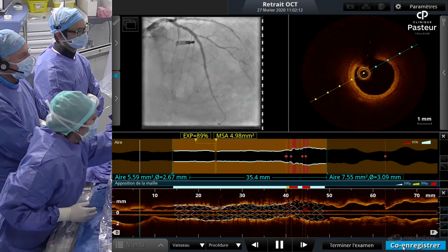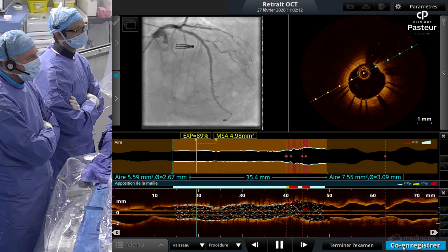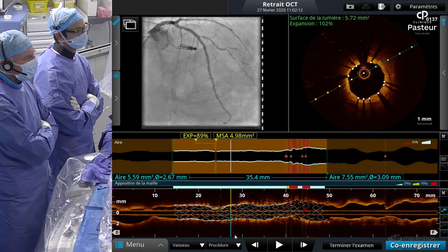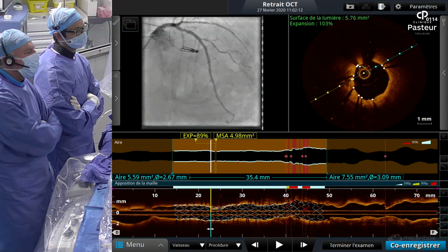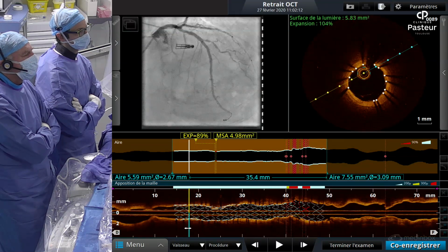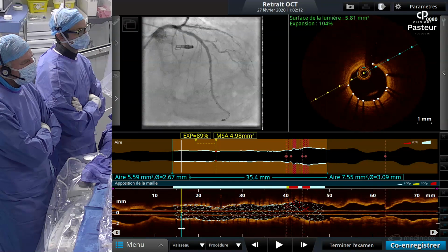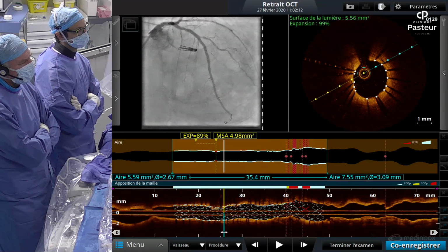What you see clearly is that all the length of the stent is well dilated, that there are no struts malapposed. You see a lot of calcium on the artery wall, which is 180 degrees from 6 to 12. And I guess that you can also see the ostium of the diagonal, which was one of the questions. Around 30, you'll be able to see.